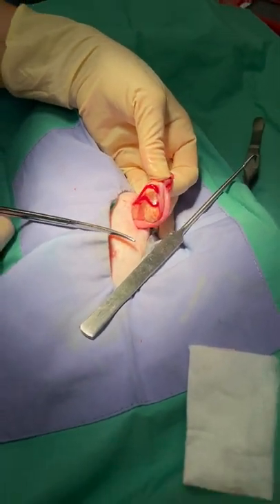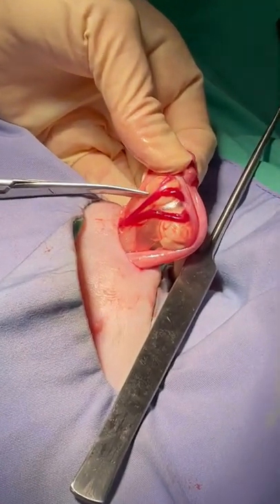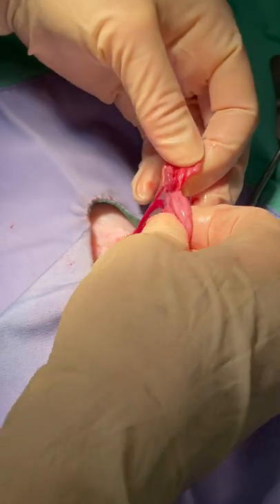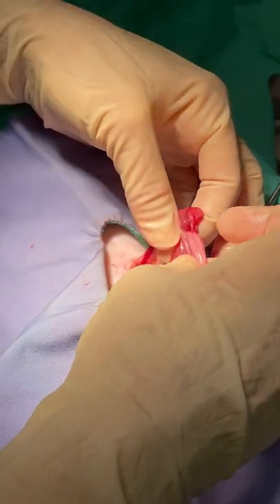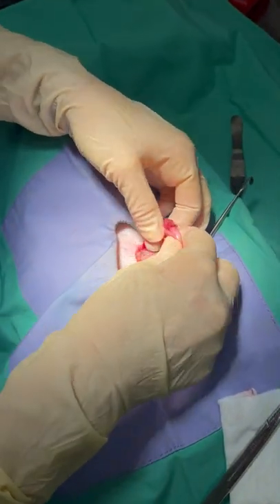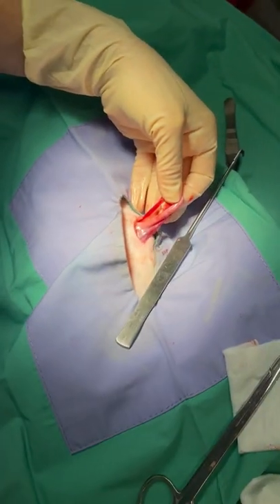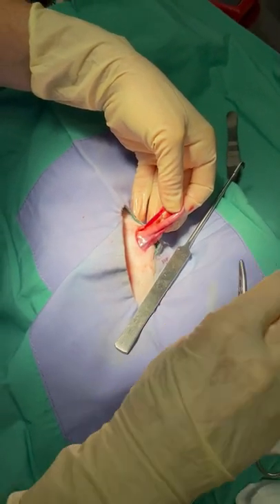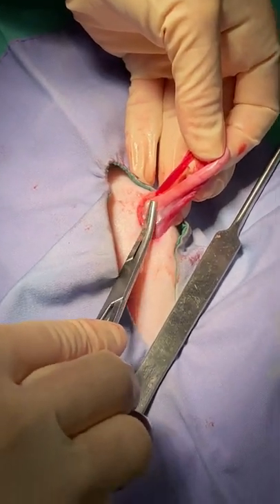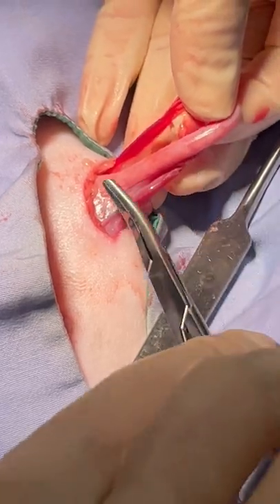This is not intuitive — it takes practice. Right now I'm going to cut the suspensory ligament, and it's going to allow me to lift this up so I can maneuver a tie. We have a surprise in here: she's pregnant, which is one reason why this is a little harder. You can see that she's got a baby in here, which is another reason why it was difficult to find her uterus — it was big in many places.